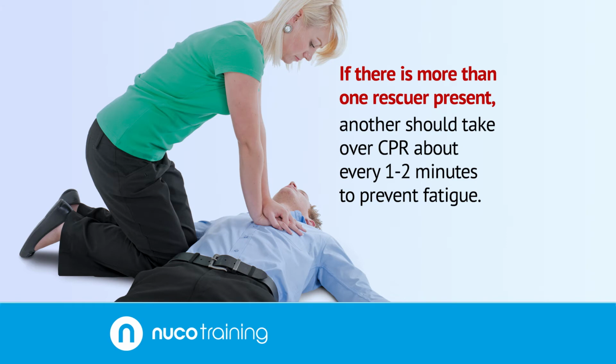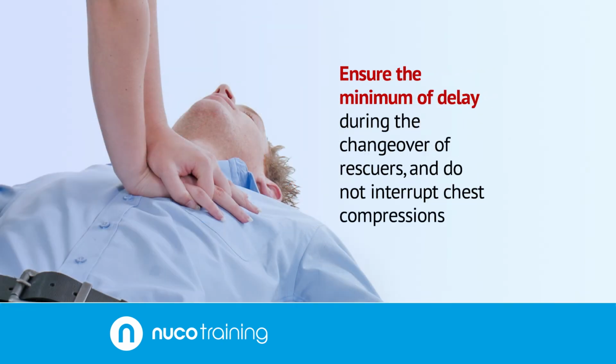If there is more than one rescuer present, another should take over CPR about every 1 to 2 minutes to prevent fatigue. Ensure the minimum of delay during the changeover of rescuers, and do not interrupt chest compressions.